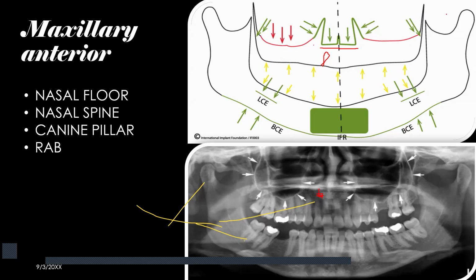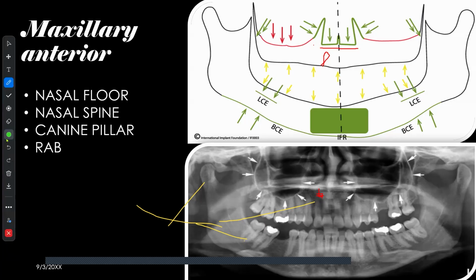Another question, why this basal bone or this lining is in green whereas this lining in the sinus is red? Now this is important. Why these linings are important? ये जो ग्रीन लाइनिंग है, ये डिनोट करती है कि ये एक स्टेबल कॉर्टिकल है. रेड लाइनिंग denotes that this cortical is not stable, that means ये रिजॉर्बेबल है, ये कॉर्टिकल श्रिंक कर सकती है, इसीलिए हम लोग इसको अनस्टेबल कॉर्टिकल बोलते हैं. इसीलिए कोई भी इम्प्लांट हम लोग साइनस रीजन की कॉर्टिकल के अंदर डाल के नहीं छोड़ते. कॉर्टिकल एंगेज कर रहे हैं तो सिर्फ वो एक वाइड बॉडी या टेम्परेरी इम्प्लांट होगा जो कि सपोर्ट देने का काम करेगा, that will not be a strategic implant. Again posteriorly यहाँ पे टेरिगॉइड है, this is a green, that means it's a stable cortical.